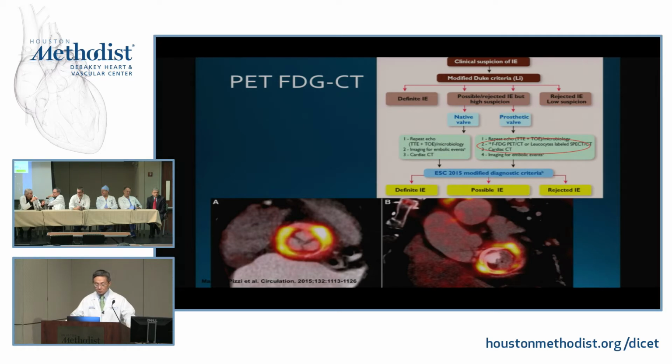The other thing is that usually when you have beam hardening, which is due to those struts, you can easily identify that because you get very high negative Hounsfield unit values, which are not physiologic. So you get minus 50, minus 80, minus 150. It's not physiologic, so you know when you see that it's an artifact.